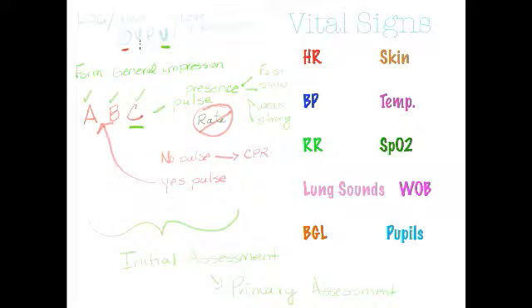And in fact, if my patient is anything other than alert, that's going to cause me to have a negative general impression for my patient, which means I'm going to start considering that they are a significantly injured or ill patient, and that's going to step up my process a little bit. So all this I've done just as I walk over to the car.